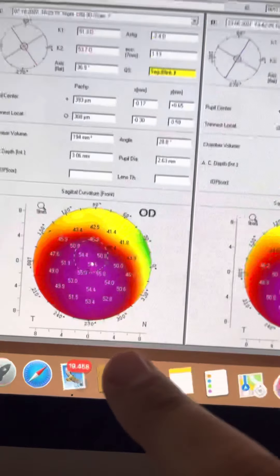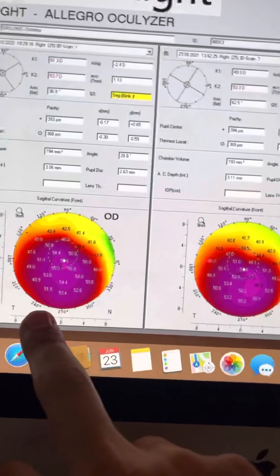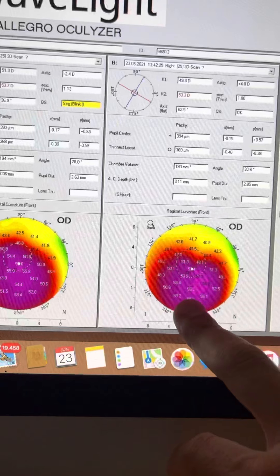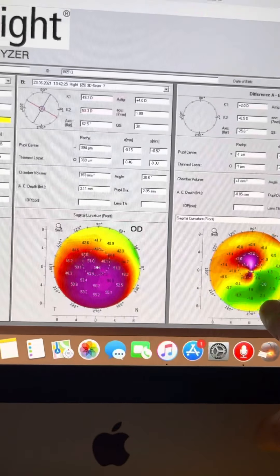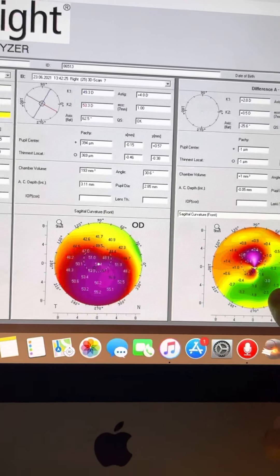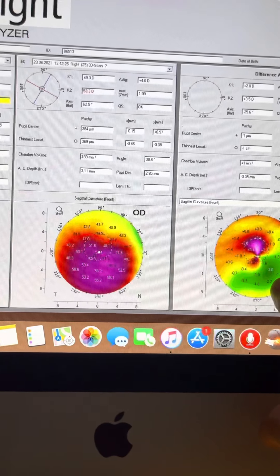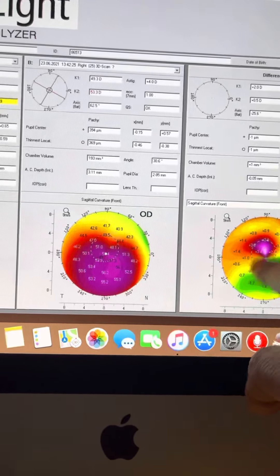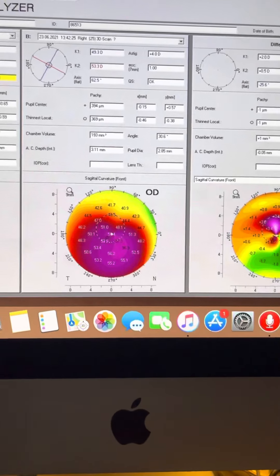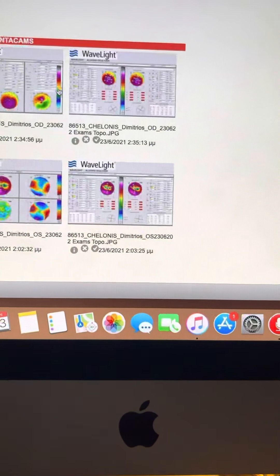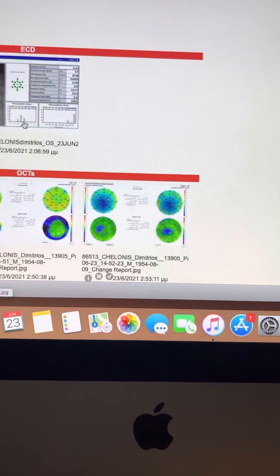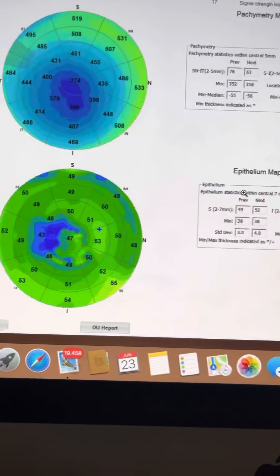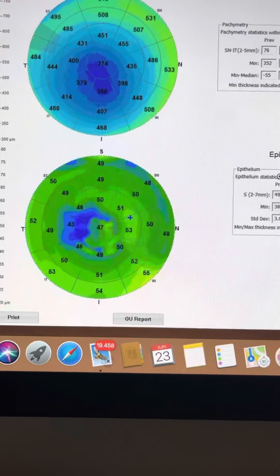So although on Pentacam there appears to be a significant worsening with three diopters of ectasia progression and more flattening superiorly, it is the anterior segment OCT that really reaffirms that there's no significant change in this patient.